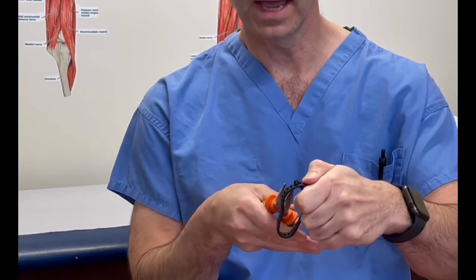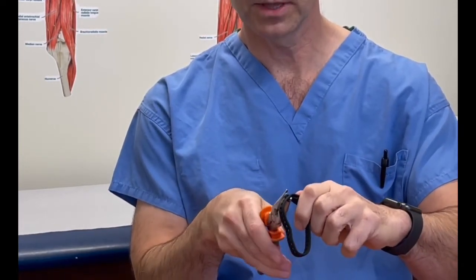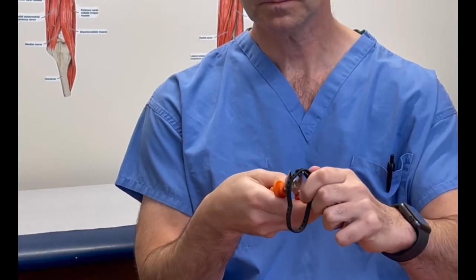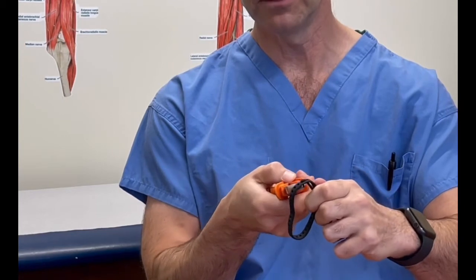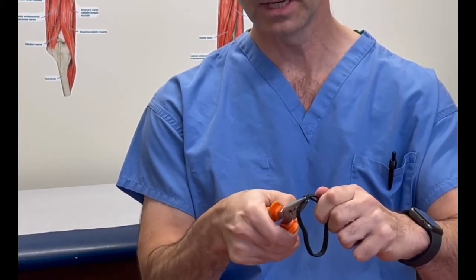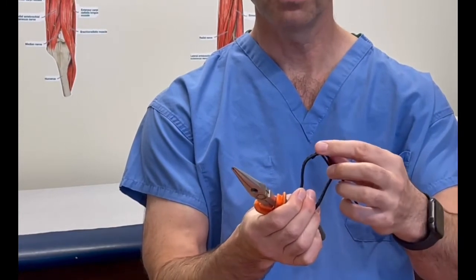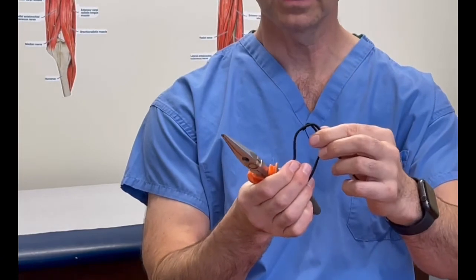Once we've done that, we can crimp down and push that through. So now it's gone through. And after it's gone through, we want this bottom tab to lay flush. We take it out a little bit and just crimp again, squeezing down on this lock. So we basically have here, it went up through one perforation, down through the next. We crimp, and you can see that's nice and low profile.